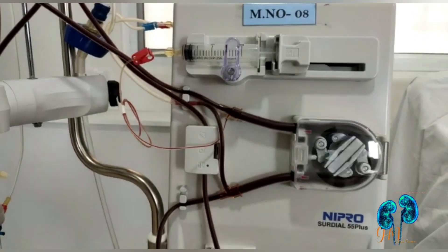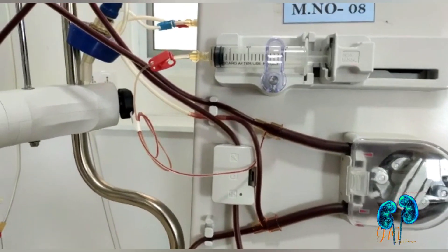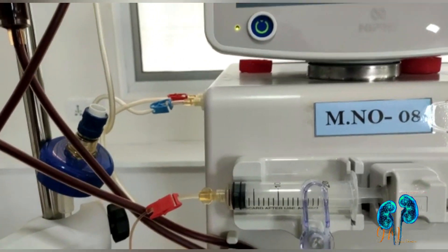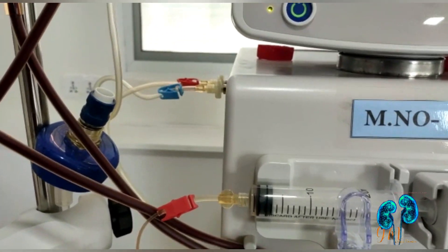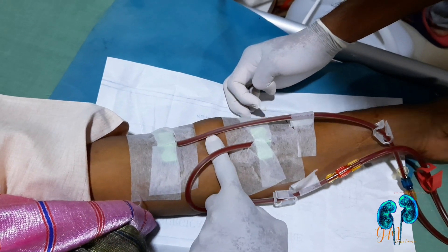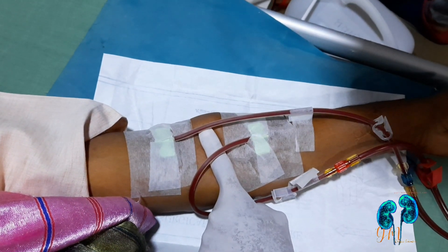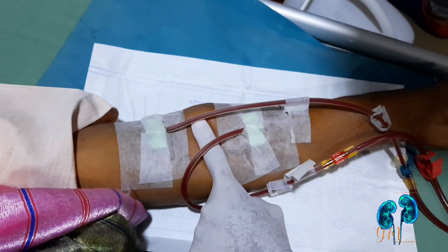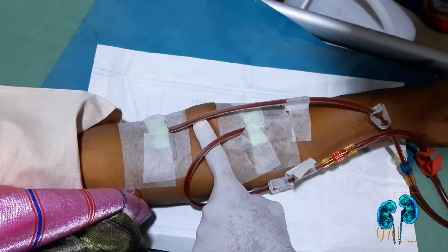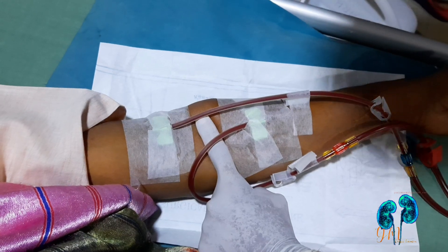For this test, we monitor arterial pressure and venous pressure. We connect both needles, set blood flow to 140 ml per minute, hold one finger between the arterial and venous needle, and monitor arterial and venous pressure to make a flow diagram.